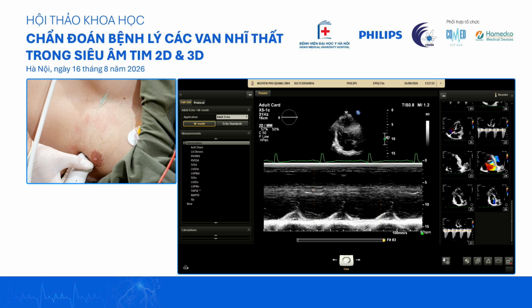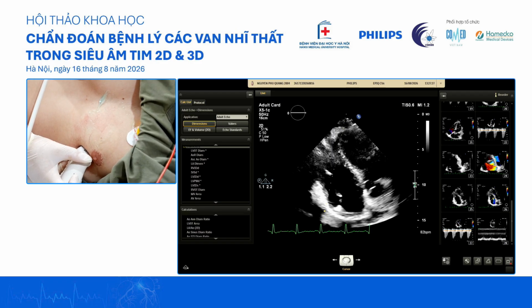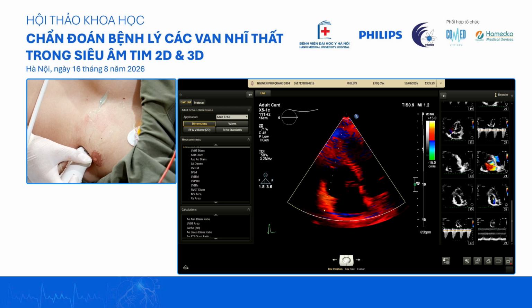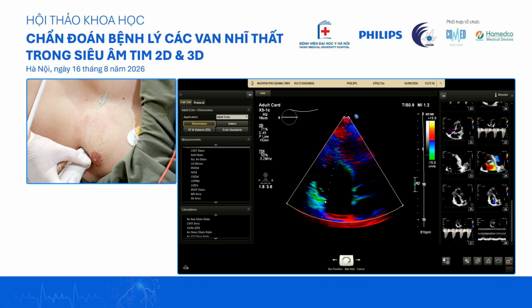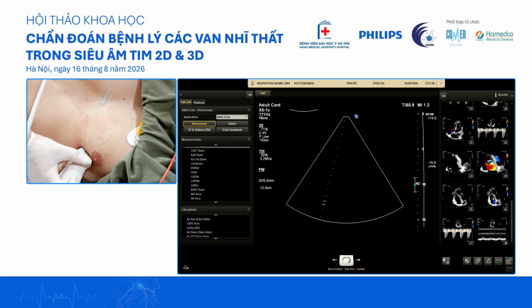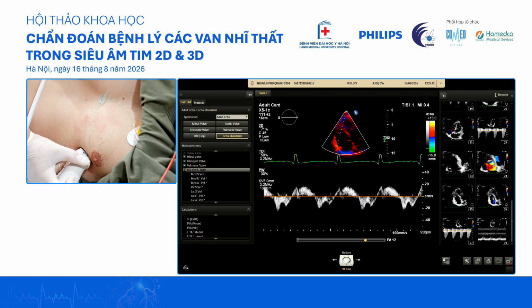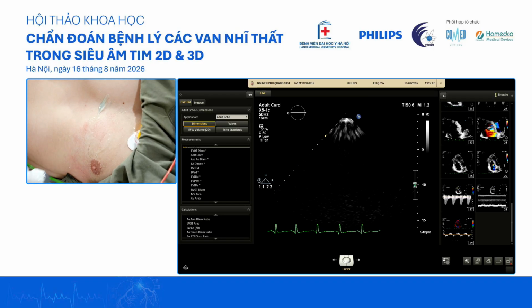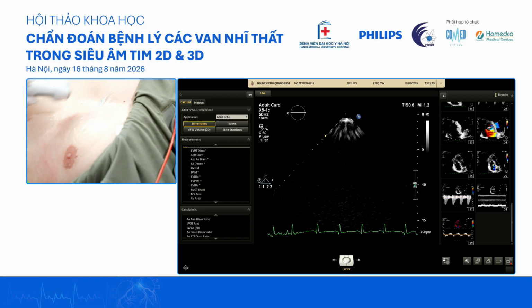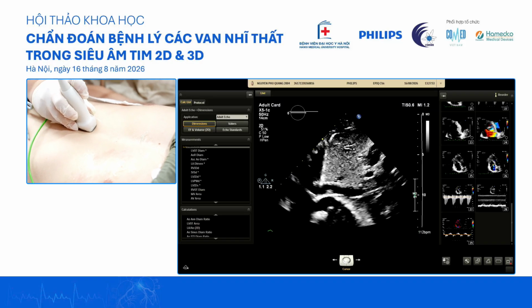We will take a TAPSE as well as a TDI, tissue Doppler of the RV annulus. Đo TAPSE và siêu âm Doppler mô của vòng van ba lá. And then we will finish this study by looking at the IVC and the hepatic vein. Và cuối cùng là chúng ta sẽ đánh giá tĩnh mạch chủ dưới và tĩnh mạch gan.